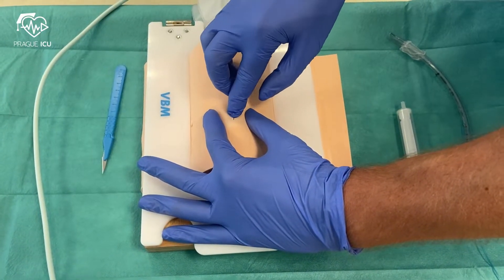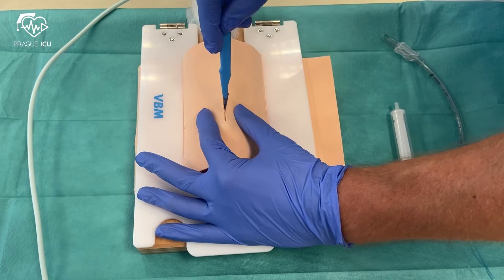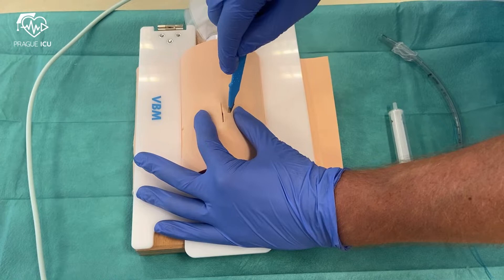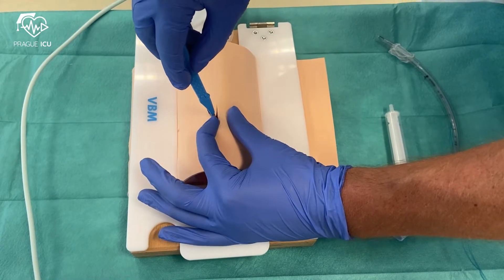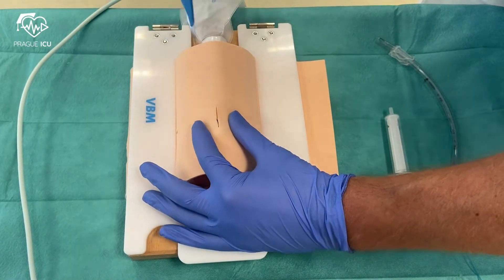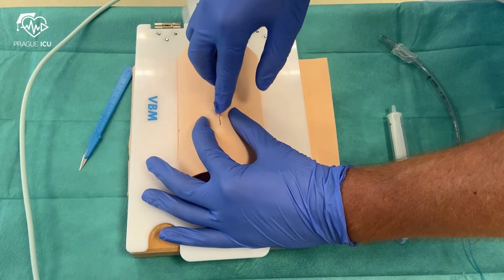Then palpate with the finger to confirm you are in the right space. Make a stab in the central part and make an incision to the right. Twist the scalpel without removing it from the hole and make an incision to the left. Again put the finger inside the hole and double check that you are in the right space.